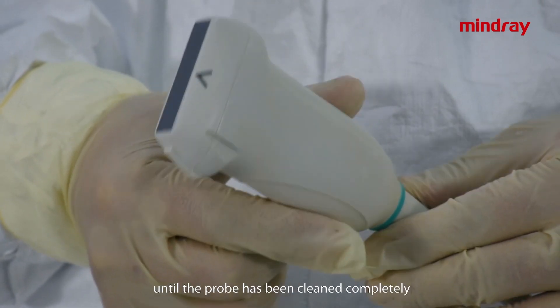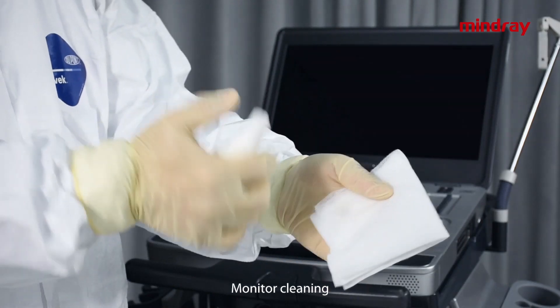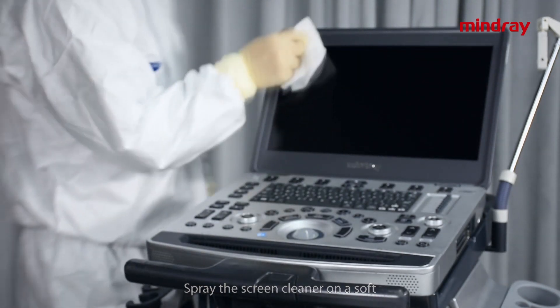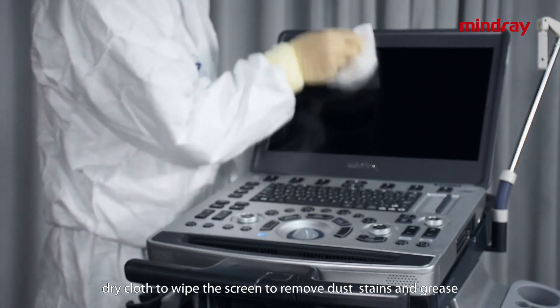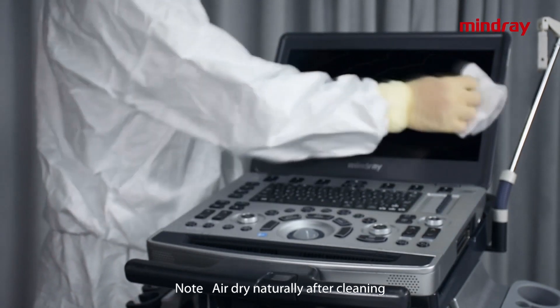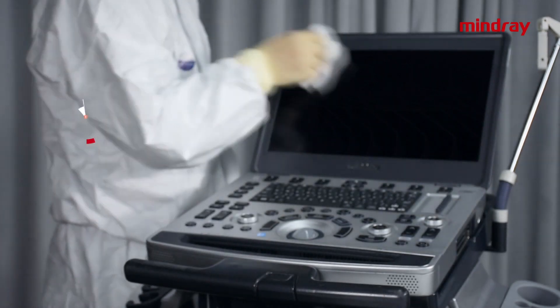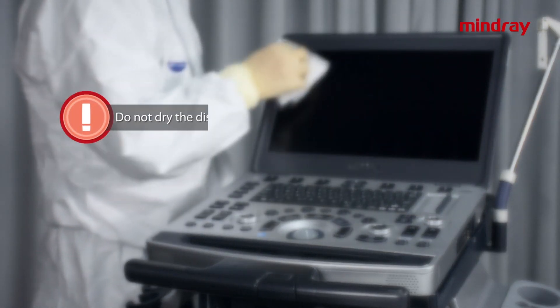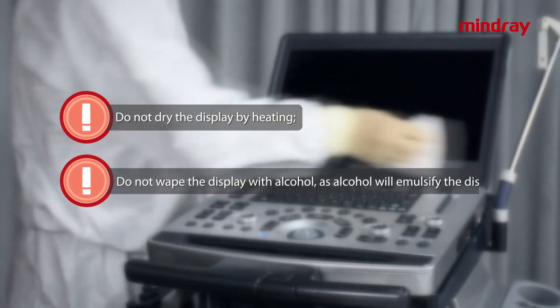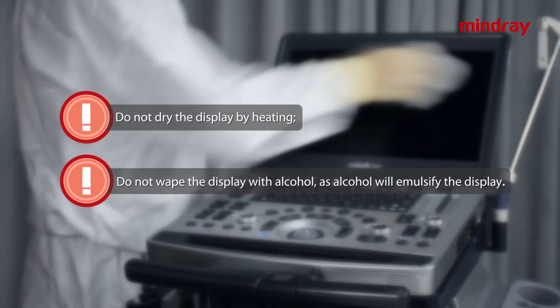Monitor cleaning: spray screen cleaner on a soft dry cloth to wipe the screen and remove dust, stains, and grease. Note: air dry naturally after cleaning. Do not dry the display by heating, and do not wipe the display with alcohol as alcohol will emulsify the display.